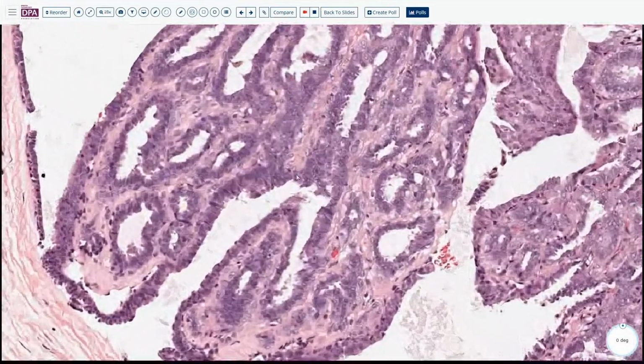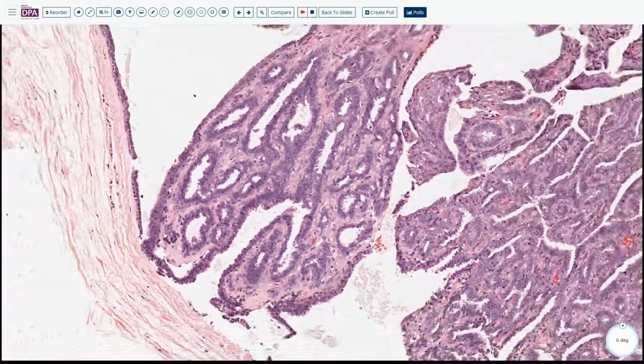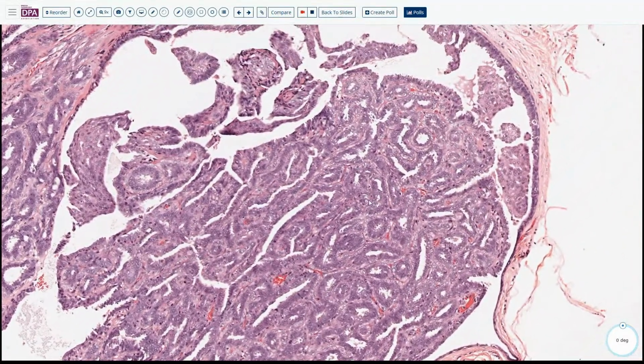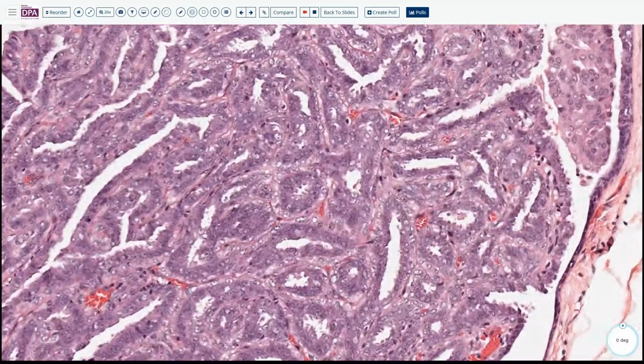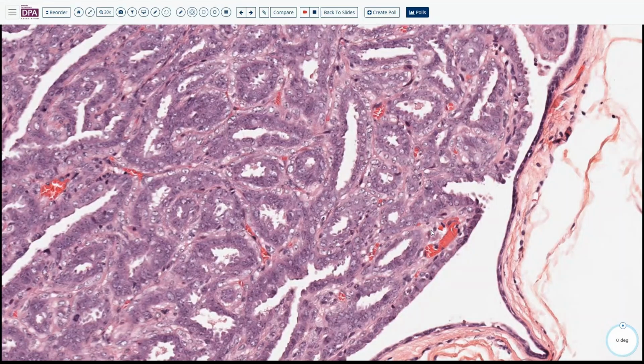So we see something inside. Often we need to find the papillary structure here or here, and then we can see we already find two populations. You can see some cells with this pale clear nuclear feature and clear cytoplasm.